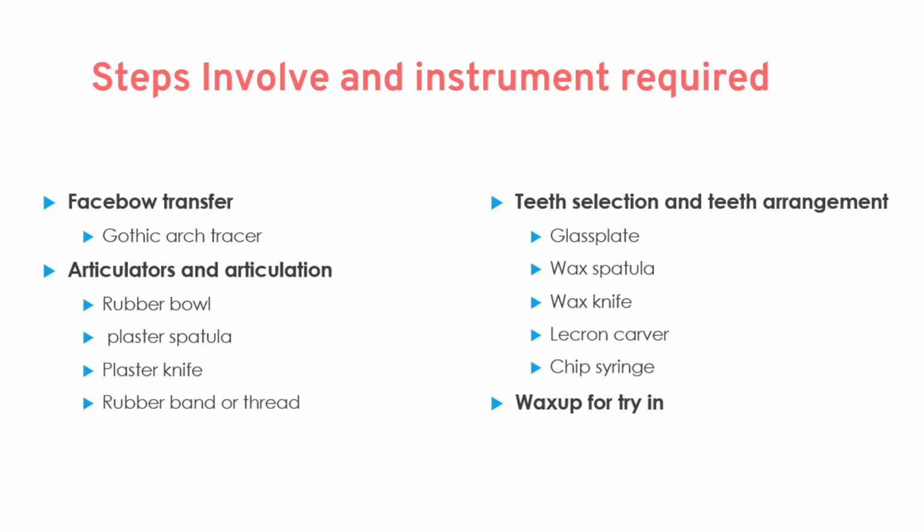One important step is, before articulation we do require some intraoral records, which are developed by using tracers, and those records will be required in programming the articulator. This step is required if you are giving the patient balanced occlusion, otherwise we can simply articulate the tentative jaw relation record, which will provide only opening and closing, not the lateral movement.